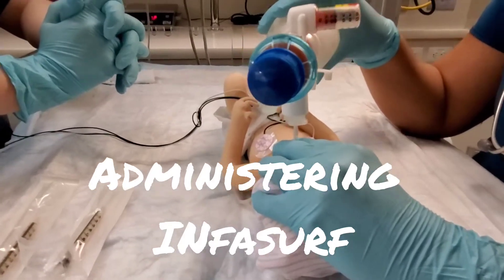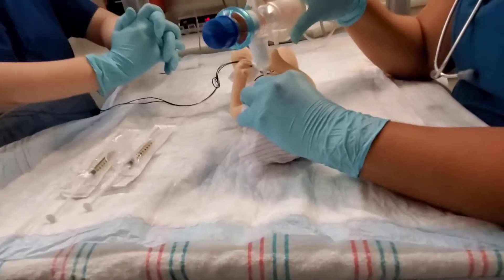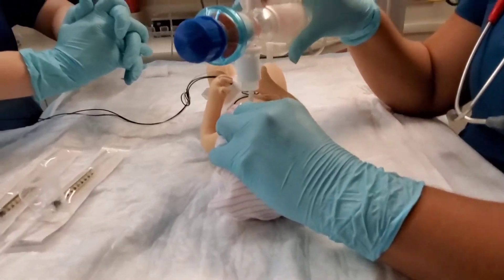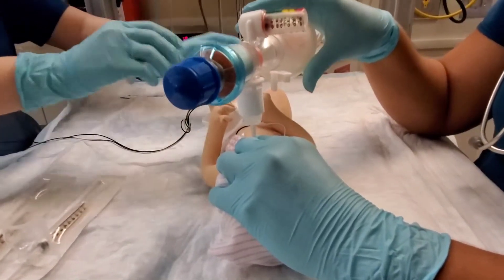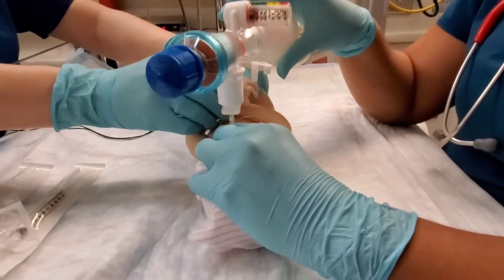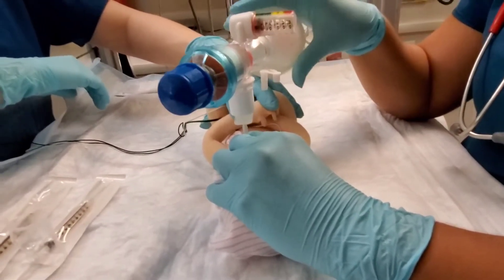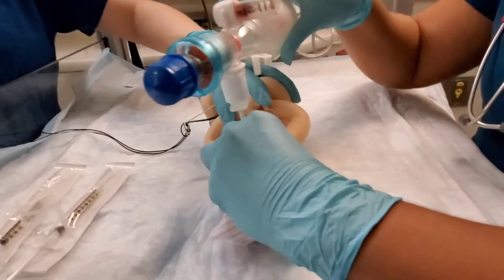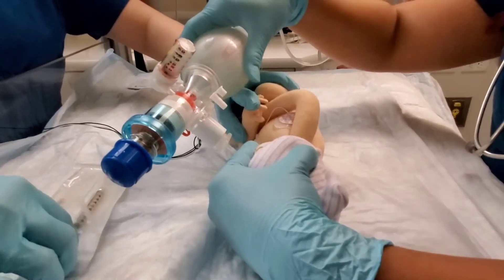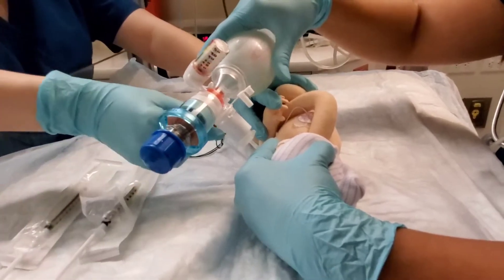We're about to give InfaSurf to the 600-gram baby. As you notice, the bed is in the flat position. The baby is going to be contained in a fetal tuck position, with a hand taking the knees to the tummy and then the arms crossed or together so the baby can hold. It's easier when you turn the baby — easier on the baby to log roll them. You want to make sure that someone continues containing the baby throughout the procedure.